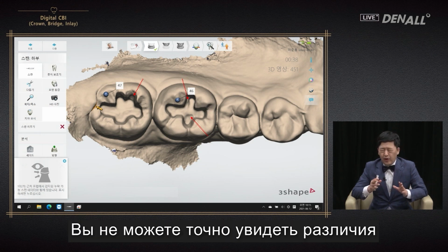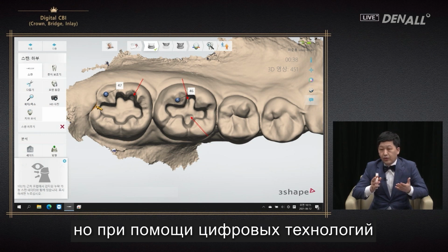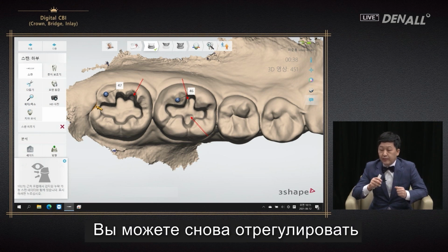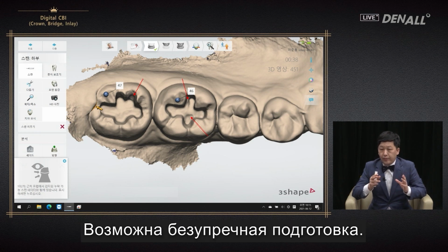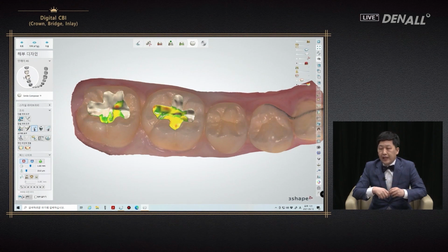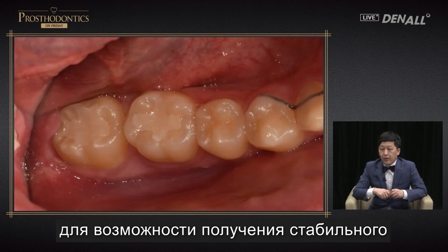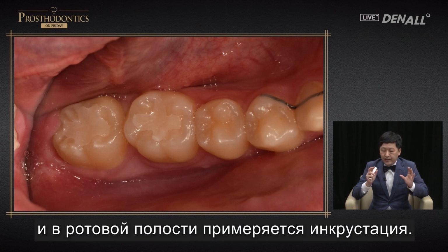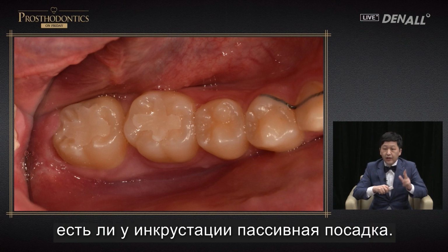You cannot see the differences clearly using impression materials, but using digital technology after scanning, you can check what is insufficient. You can adjust once again and rescan very easily, and impeccable preparation is possible. This information is sent to the design PC and the final design is done. After that, milling is done and the inlay is tried in within the oral cavity. You need to check whether the inlay has a passive fit.